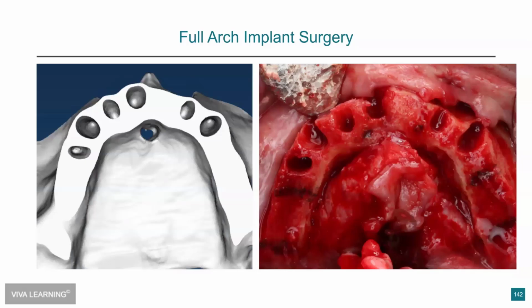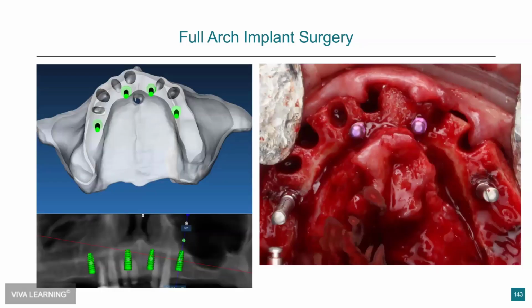Now, this on the left, I'll print, so I'll have a 3D model in my hand, and I can measure, for instance, the socket of number 6. And then I go in the mouth and measure it in the mouth, and I can determine if I'm at my planned plane yet based on what I'm holding in my hand. You know, I know I should have exactly 6 millimeters left of socket number 10, and I go in the mouth and check. It's a lot easier than trying to click through the software, do a measurement, go to the mouth, and so on. So it's nice.